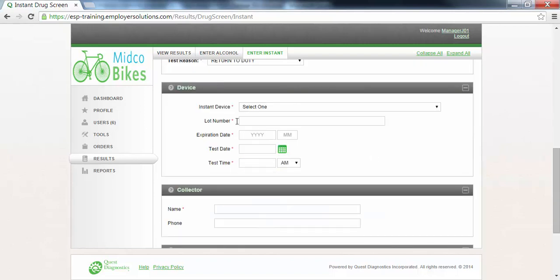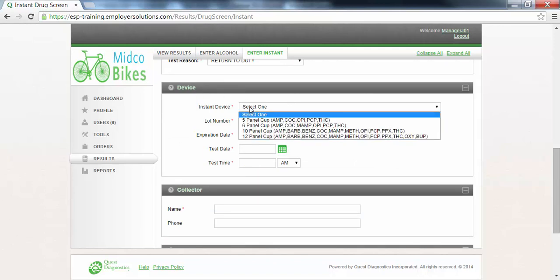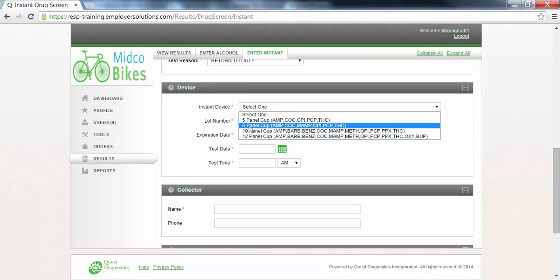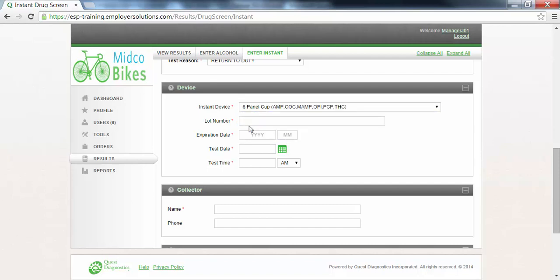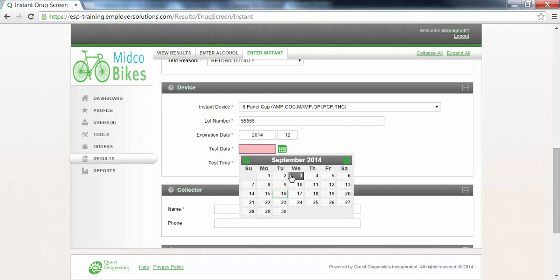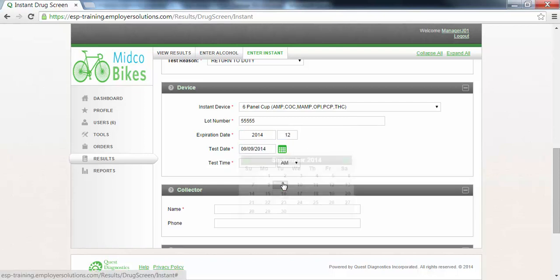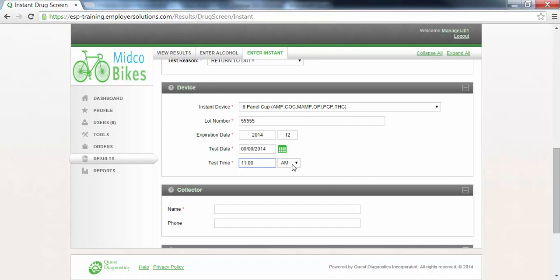The device section is where you will identify the device and the details about the device used for testing. Select the instant device drop-down and select which device was used. Enter the lot number of the device which can be found on the device packaging. Enter the expiration date of the device. Use the calendar select to select the test date. Enter the test time and use the drop-down fields to select AM or PM.